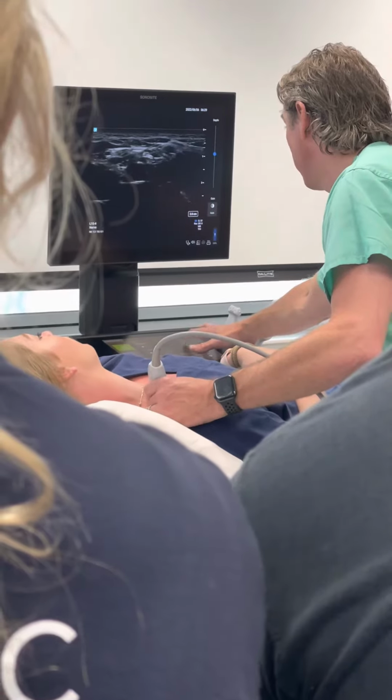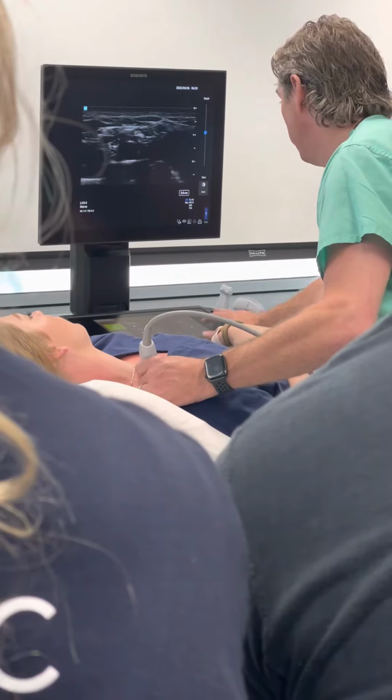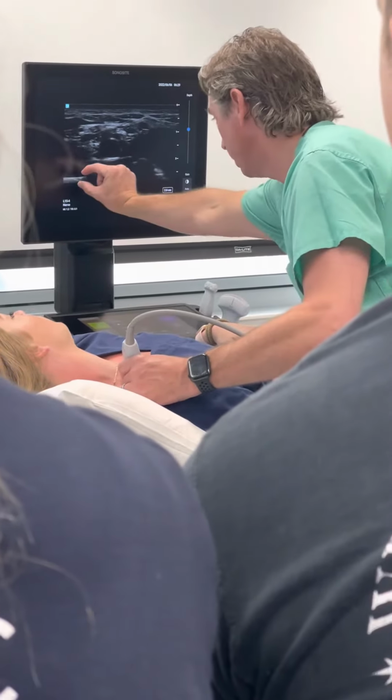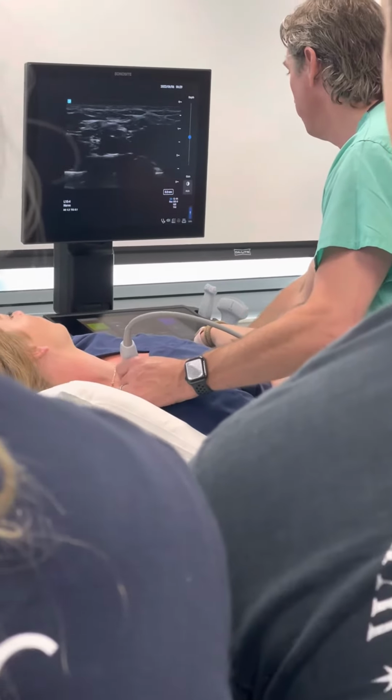So notice how it just all of a sudden is not so bright there. Let's turn up our far field gain. Oh snap, what do we start to see moving in and out of our view there? But we barely see it. Like, notice how it's just the very bottom part of the screen. So let's give ourselves a little bit more depth.